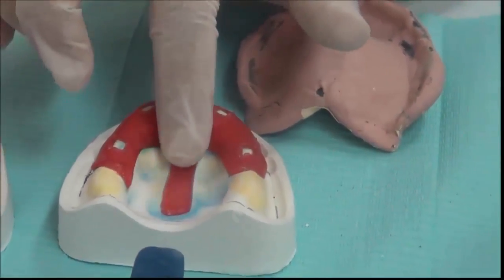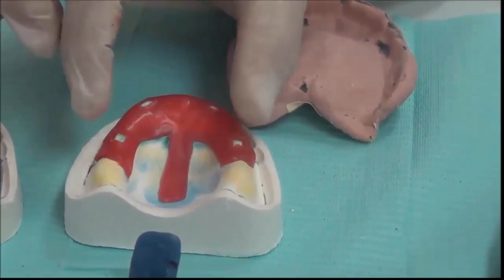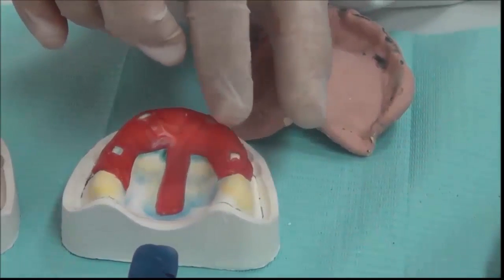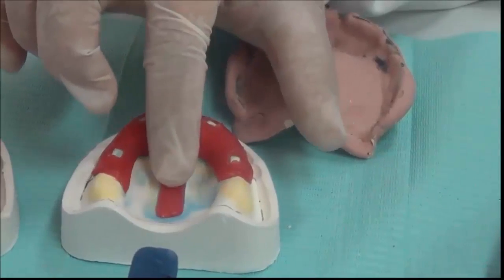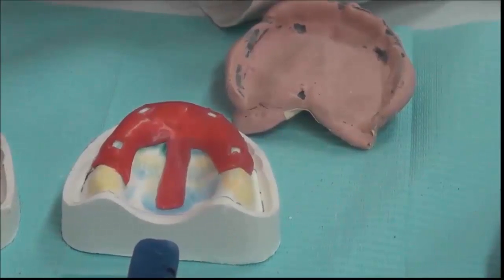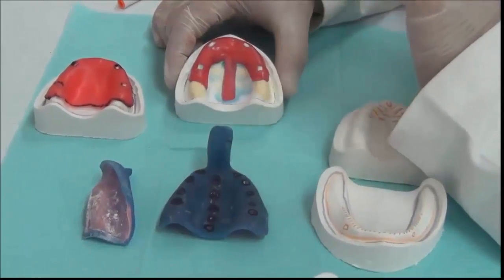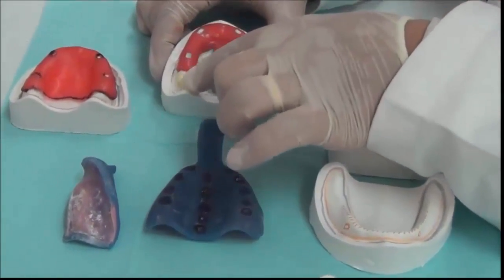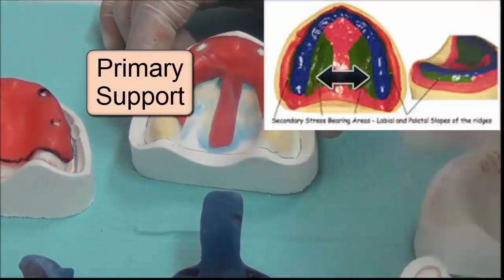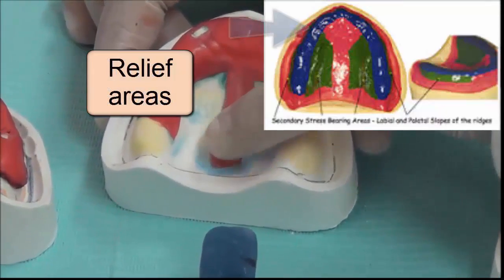In the areas where there is a spacer, the impression material will have space for it to set. It will not be squeezed firmly between the tray and the tissue, so we will have a mucostatic state of the impression material. So in these areas, we do not have pressure on the tissue. On this cast, you see that the denture bearing area is divided into two parts. The areas that will be compressed, and those are called primary support areas, and the areas that will be relieved, and these are called relief areas.